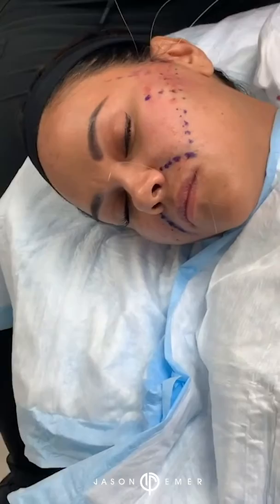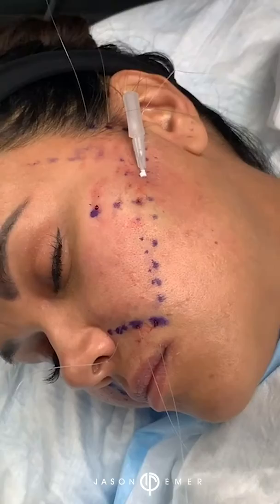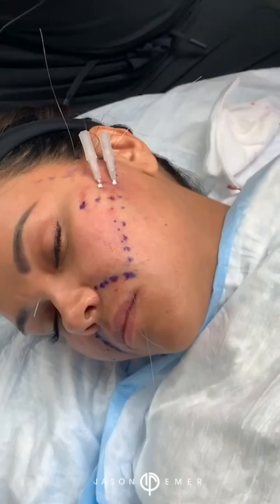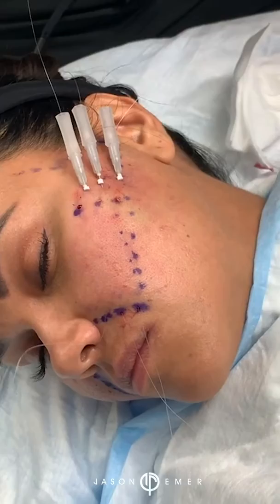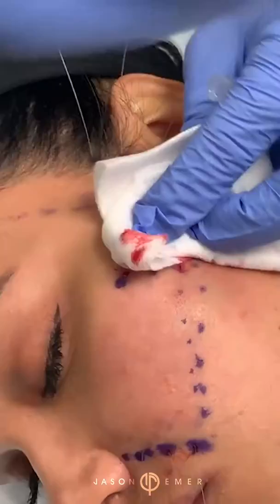How is this different from Nova threads? Well, that's what we just discussed — go back in the video and you can learn that. But I'm also going to show you here — I'm going to throw in some additional threads. These are Nova threads but these are the smooth ones, and to give her more contour laterally we're going to throw a couple of these. We're going to do a little pinch, throw right under the base there, and what that's going to do is help give a little bit more tightening to that area — a little more definition in between each of these threads. These longer smooth threads are going to give more collagen production for her. Right through that area — one more — to give her a lot of lifting here and collagen production long term. All the way down to the fold, those now embed under the skin right beside those other thicker threads.